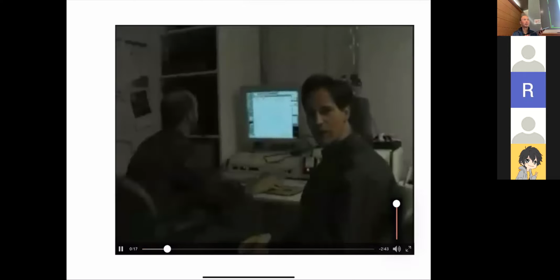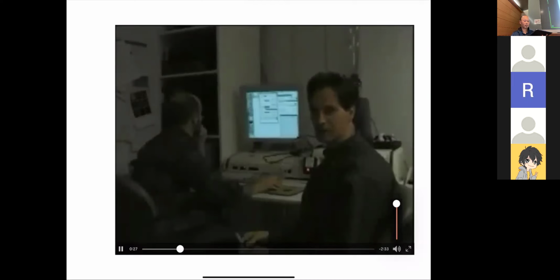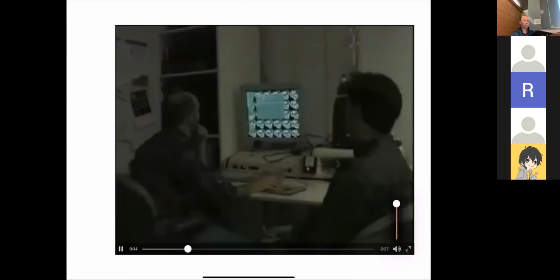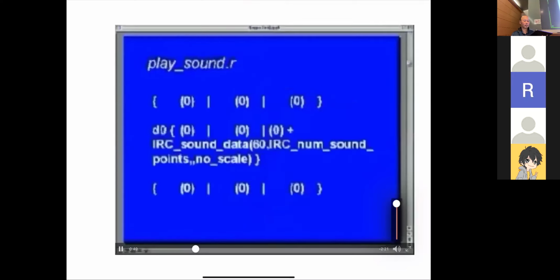A continuing problem with fMRI is synchronization of the stimulus with the scans. The Imaging Research Center has addressed this problem by requiring the gradients themselves to issue audio prompts to the subjects. Sound files can be directly recorded into the SGI. A C program is written to store the file in an array. It is then downloaded in real time into the gradient waveform memory using the pulse program shown here.